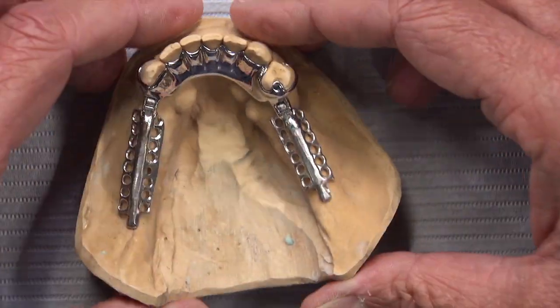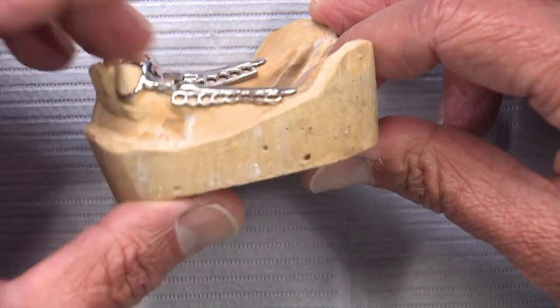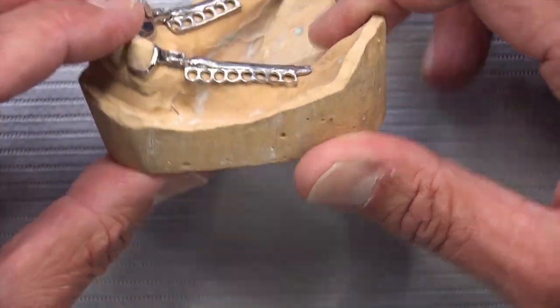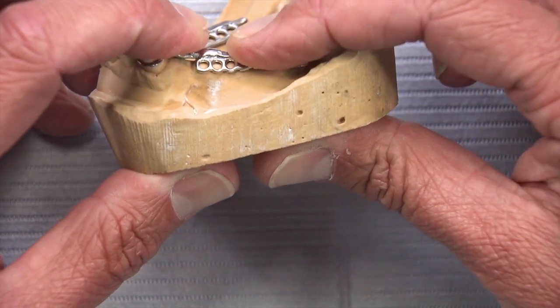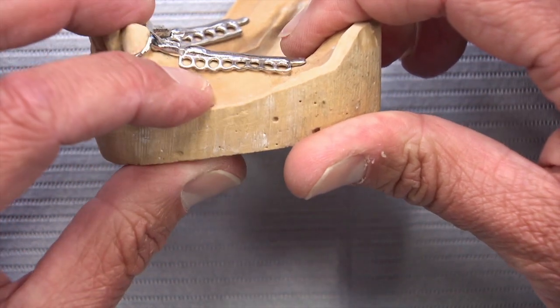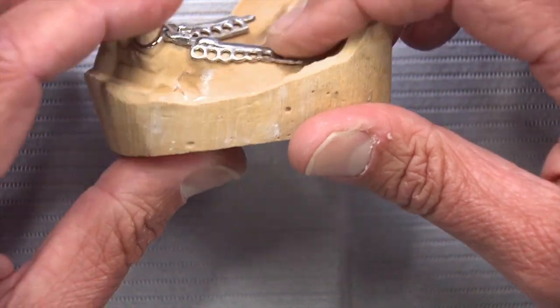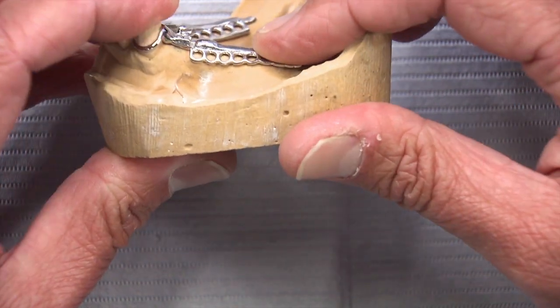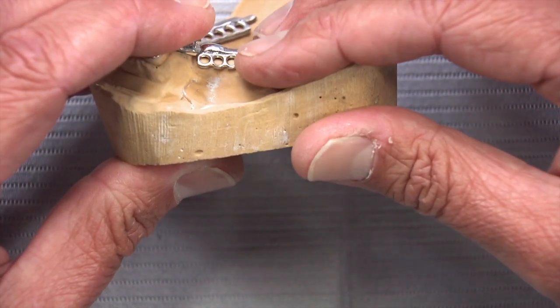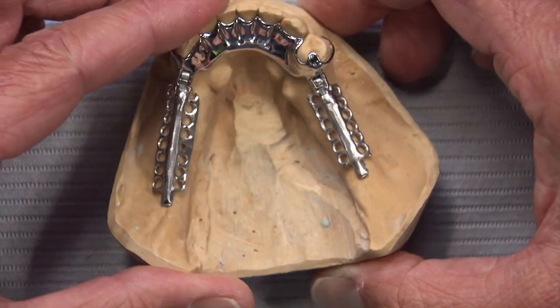By sparing those anterior teeth that stress, we're not pushing them distally or making them more mobile. The edentulous ridge takes up more of that stress, so we're going to see faster resorption of the ridge — because when the patient chews down, the hinge allows the saddle to be pushed down harder. As the ridge resorbs underneath the saddle, it may start to feel a little loose. The saddle will continue to go down with the ridge but also come back up with sticky foods.